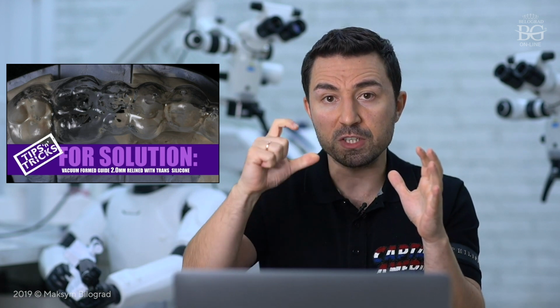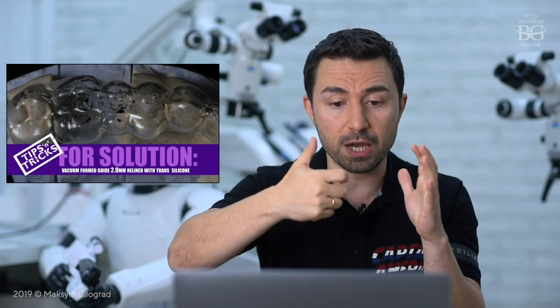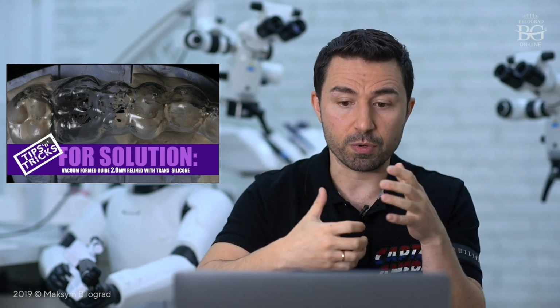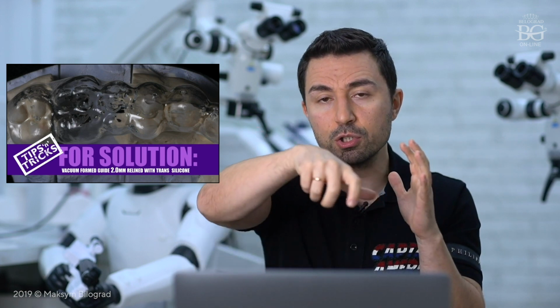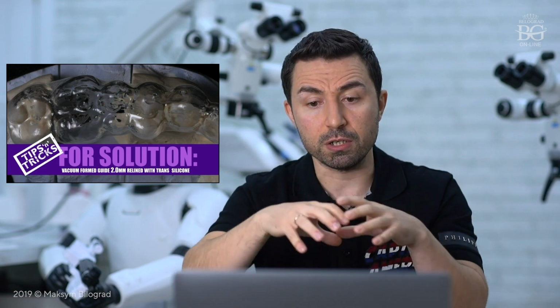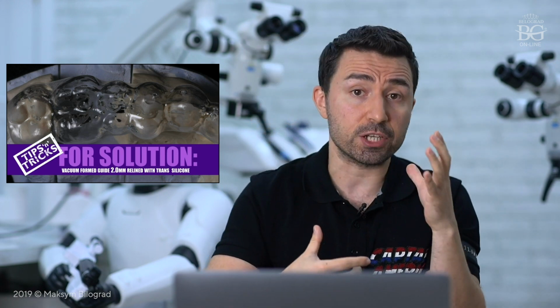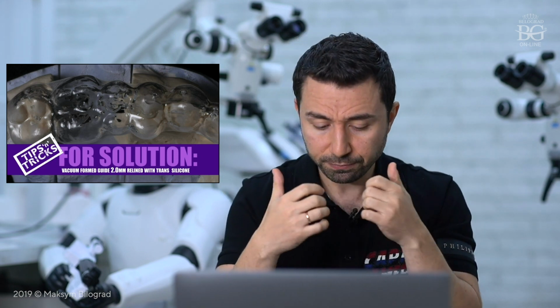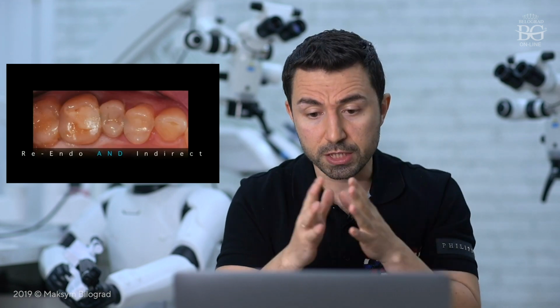Then you take special adhesive that we're using for customized trays, for taking silicone impressions. You take this adhesive for silicone impressions, and then you inject your transparent silicone inside this tray, and also some silicone may be injected into the wax-up, and then you take impression with this tray. So literally you will reline this tray and you will get a nice reflection of anatomy and texture from the wax-up. This is the trick. So let me show you how it works in posterior areas.